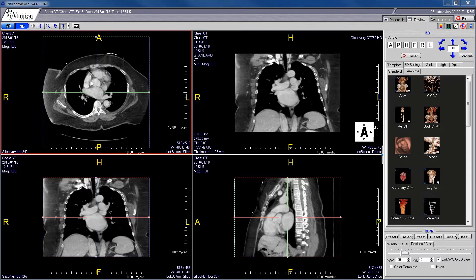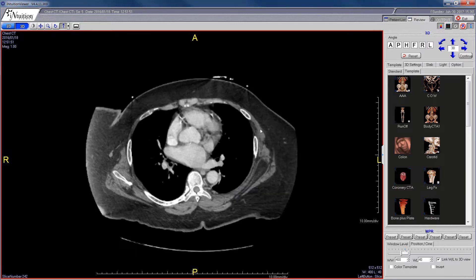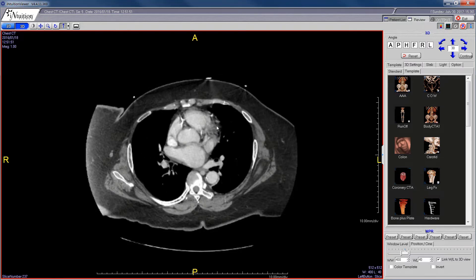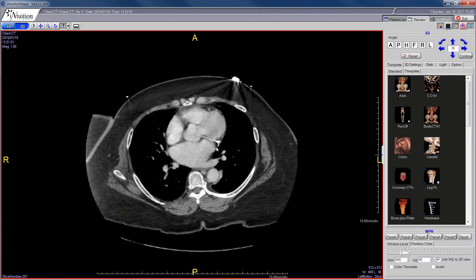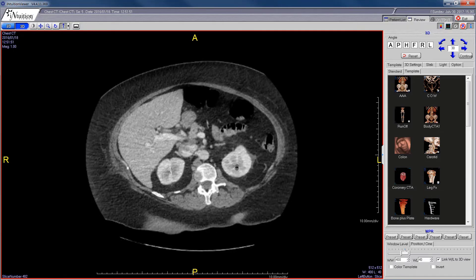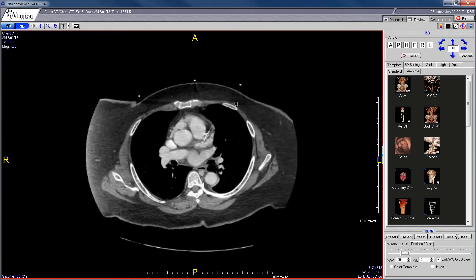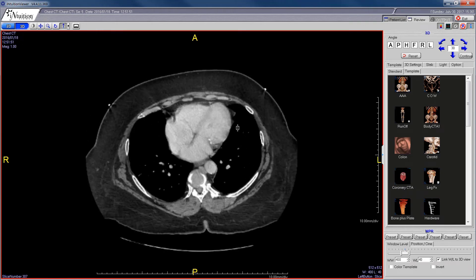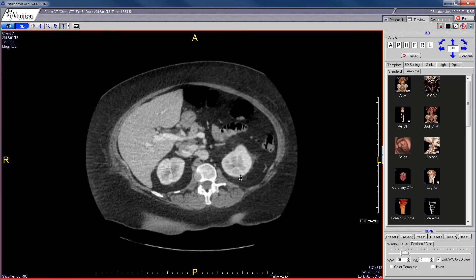To make any of these images bigger, you can double-click on the image and it will fill the screen. There are a couple of ways to scroll: one is to use a mouse scroll wheel to scroll up and down, another is the up and down arrow keys, or you can hold the left mouse button down and drag up and down, which goes much quicker when scrolling through many images.